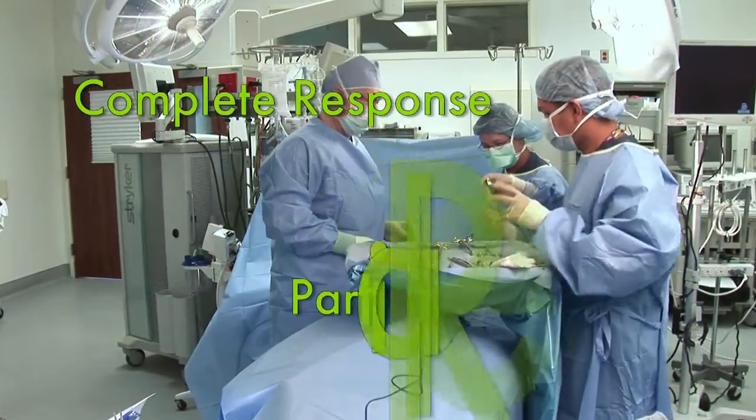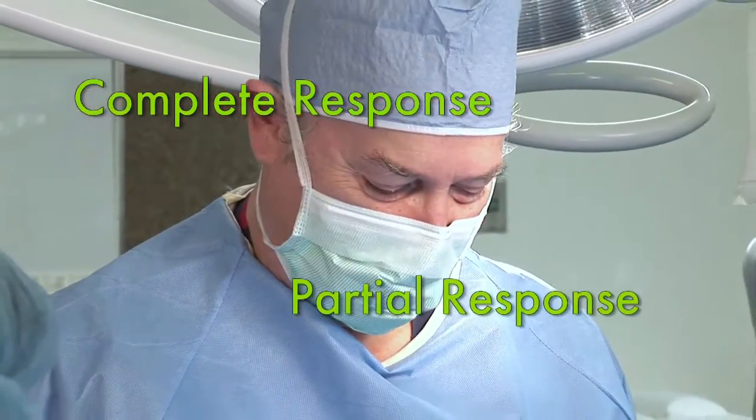Tools that we look for are things that can help us quantify changes in tumor size, changes in the amount of necrosis, and equally important, continuing to follow the amount of necrosis to look for progression, which will tell us when an alternate therapy or a second treatment may be necessary. Complete response or partial response. How do you make the call? And how do you answer the question, "Doc, am I getting better?"